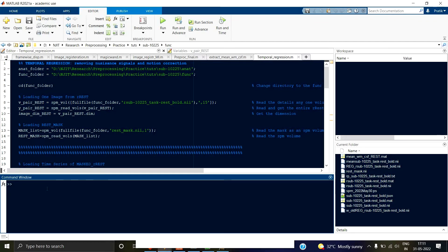Hello guys, welcome back to this series on pre-processing resting state fMRI data. In this video we'll see the need for normalization, the need for going into the MNI space, then we'll see how we can map our subjects into that space, and finally we'll see what smoothing is. This video will more or less complete the entire pre-processing that is essential for resting state fMRI data.